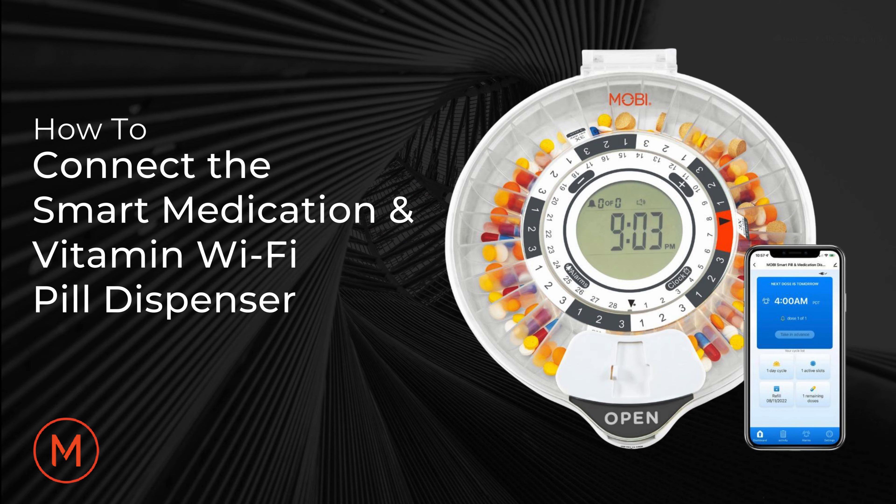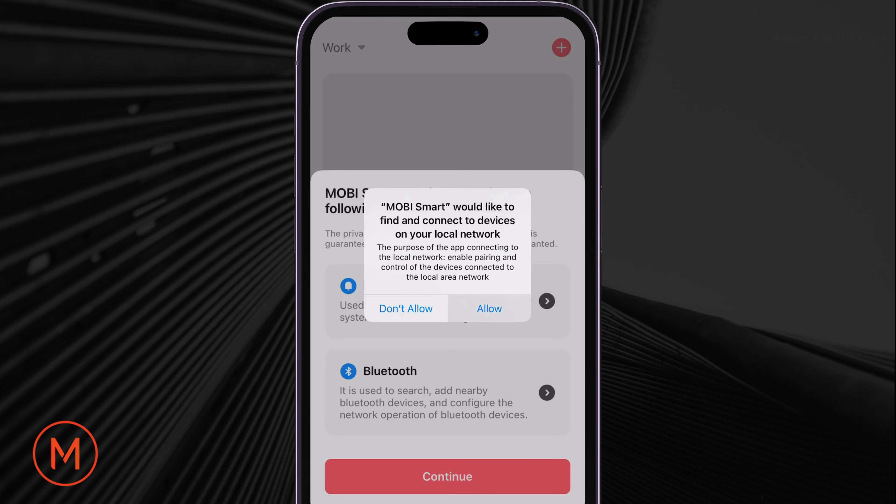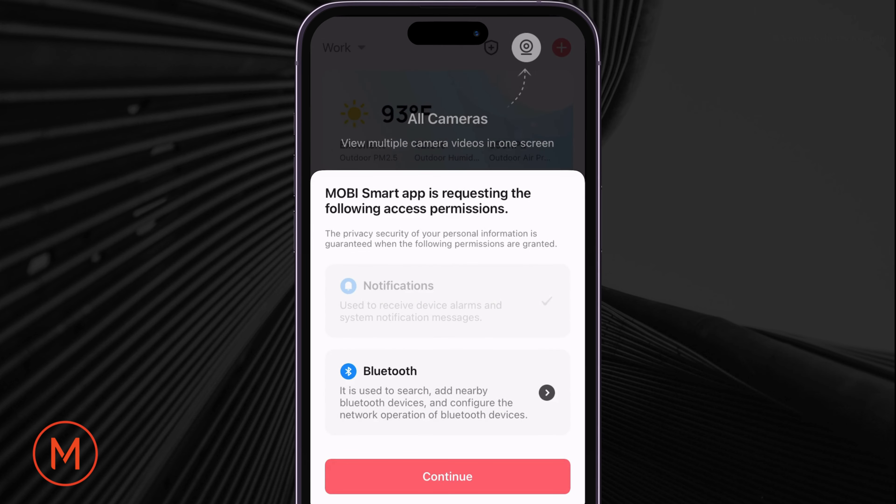I will now demonstrate how to connect your smart pill dispenser to your smartphone. First, download the Mobi Smart App and sign up for an account. Please accept or allow any pop-up messages that the app asks for, such as Bluetooth, location, and notifications.